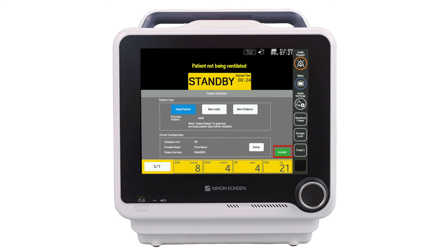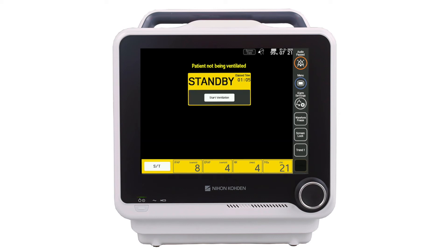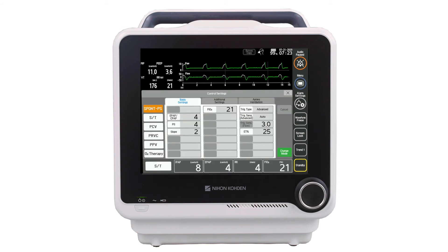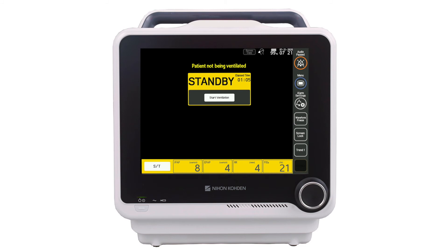Press Accept to go to the circuit check and calibrations window. This window displays the current calibration status and allows the clinician to perform calibrations when needed. Press X to go to the standby screen. Prior to starting ventilation, clinicians can pre-select the mode and ventilation control settings and alarm limits. When ready to begin ventilation, press the start ventilation button.